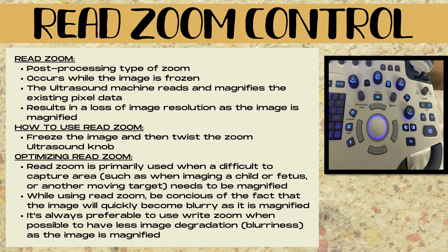To use read zoom, you freeze the ultrasound image and then twist the zoom knob. Read zoom is primarily used when a difficult-to-capture area — such as when imaging a moving child, fetus, or another moving target like the heart — needs to be magnified. While using read zoom, be really conscious of the fact that the image will quickly become blurry as it is magnified.